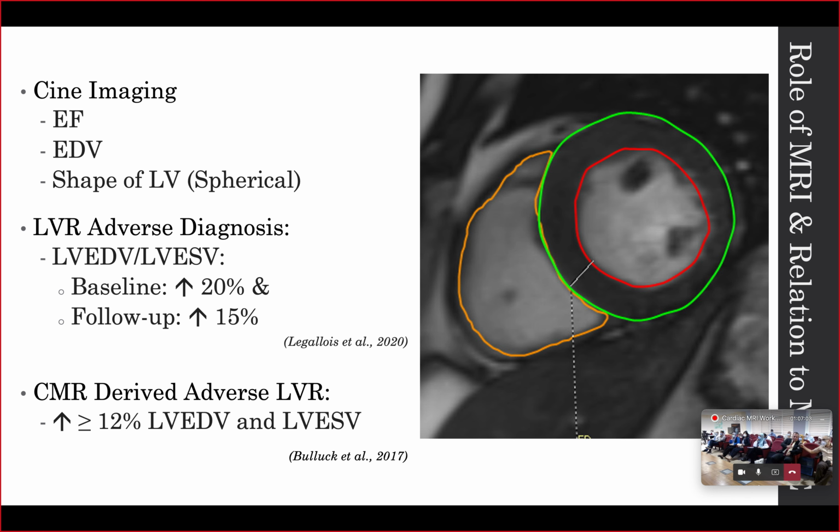Thank you. The edema, usually most of the literature says that the edema and the MVO would be resolving within 3 to 6 months. That's why it's recommended to do the follow-up at 6 months to 1 year, to give an opportunity for the edema and the MVO areas to wear off.